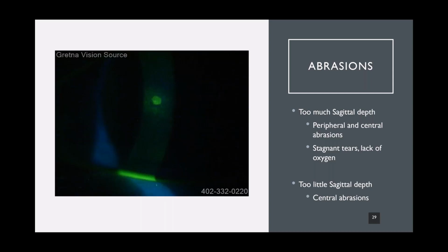And some doctors will actually use the strategy of molding them in 2 different sets of molds. Like maybe you take them halfway with one lens, and then after they've responded to that lens, you redesign another lens to bring them the rest of the way, so that you're not pushing on that cornea, so that you are able to still retain that 10 micron layer of tear film between the center of the lens and the apex of the cornea. And hopefully that makes sense.